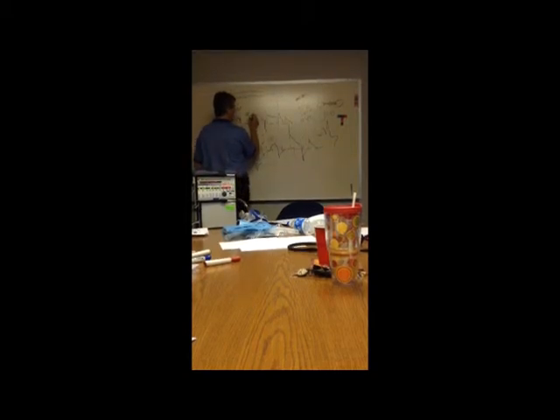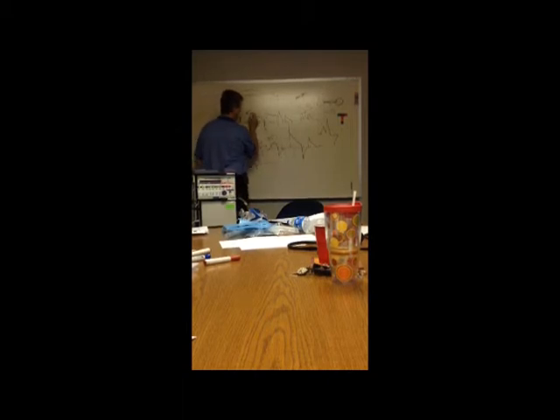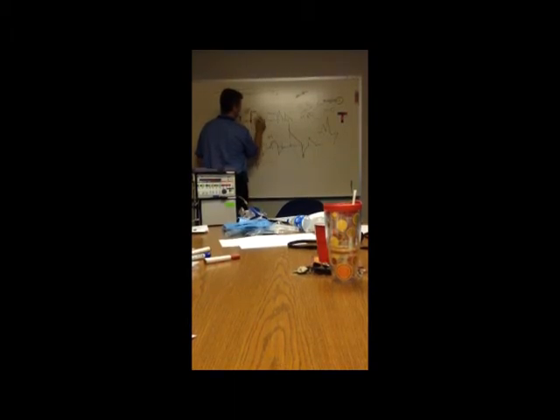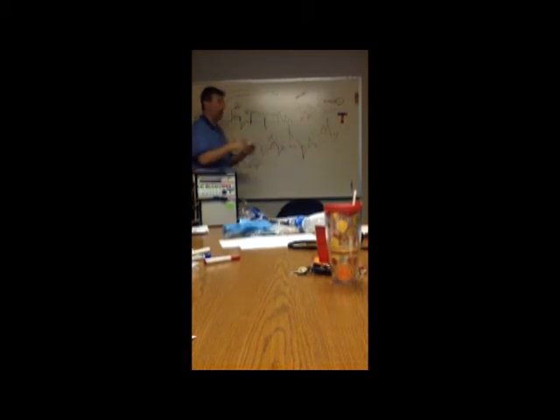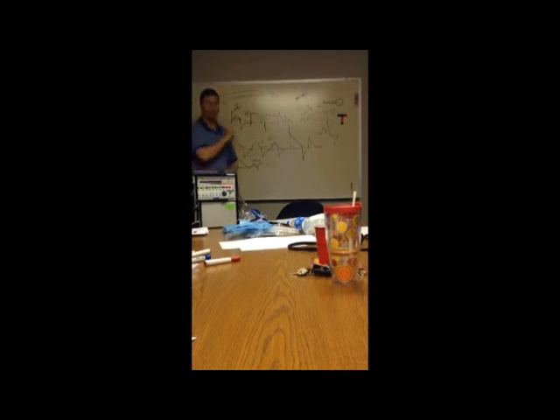As opposed to this one, which decreases how fast it's blowing in, and then lets them exhale when that amount is reached. This one inflates them to 25, holds that 25 of pressure for the entire second, no matter how the shape is. This is all how the flow is slowing down. Whether they're opening up, if their lungs are really stiff, this may be more out here. If their lungs are very compliant, it's not going to take long at all. But the point about this is it inflates their lungs to that pressure as fast as it can. It holds it for the entire set I time, and then it lets them exhale.